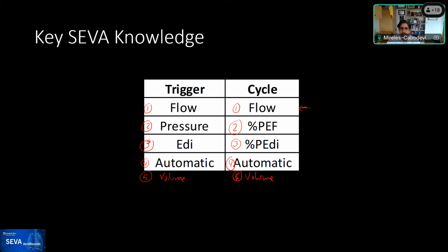Yeah, it's complicated, right? It is, but the interesting thing is that you can imagine as things get more complex, or you're dealing with adjusting ventilator settings, that having knowledge of how you trigger and how you cycle the breath may have impact in terms of synchrony. And this case in particular, you'll see as we evolve. All right.